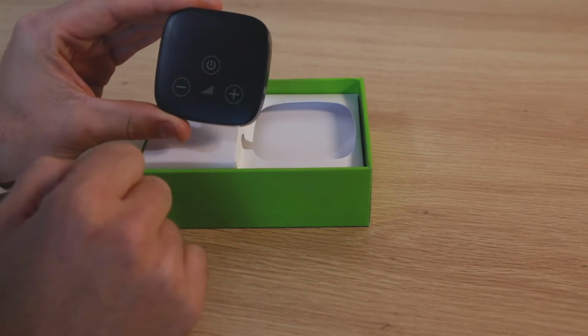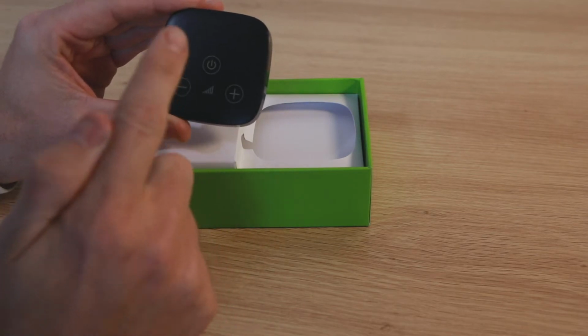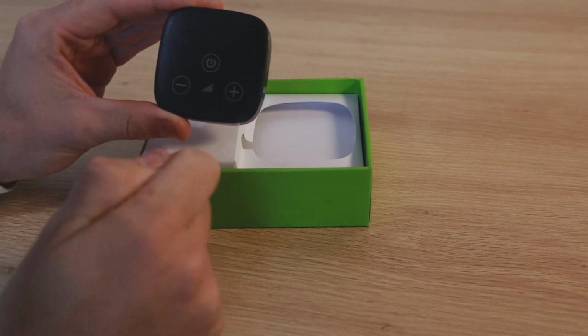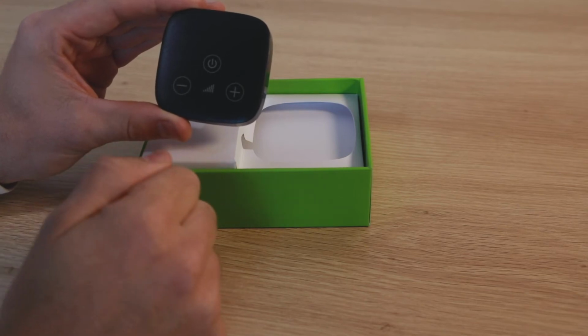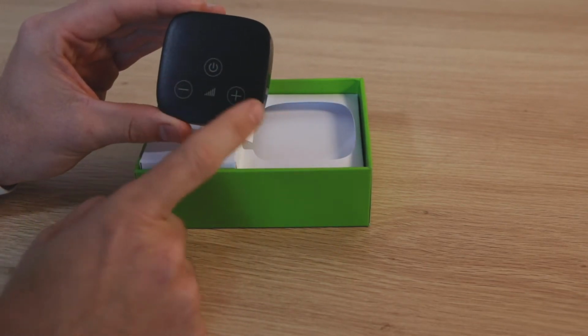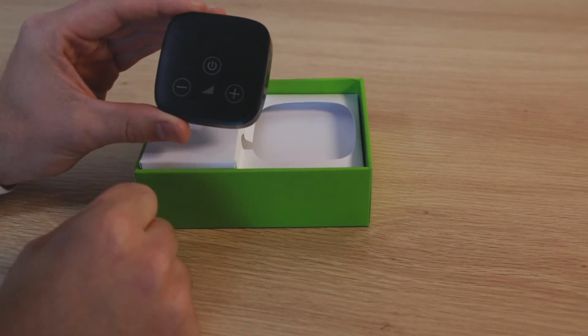This is your power button here. When you turn your TV on and off, once that power button has been pressed, the TV connector, when the TV is turned off, will go into standby mode. So once it's set up, you don't have to touch it again. You also have here, for convenience, volume up and down as well.